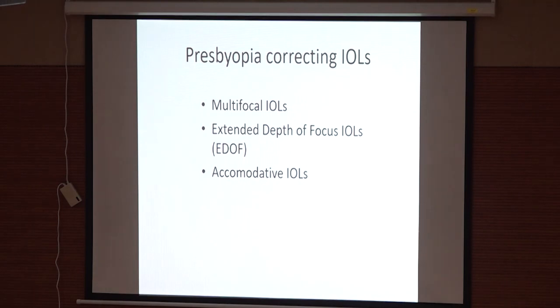And like I said, the presbyopia-correcting IOLs, we have the multifocal IOLs, and now there is a renewed interest in using spherical aberrations to improve the depth of focus. And in between, we also had the availability of some accommodating IOLs, but somehow they did not provide adequate levels of pseudo-accommodation. So generally most of the accommodating IOLs in today's time are really a historical perspective.